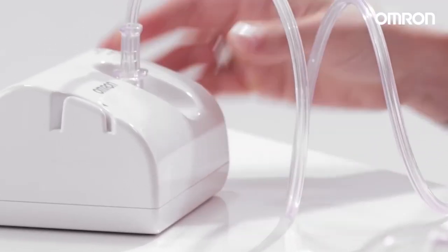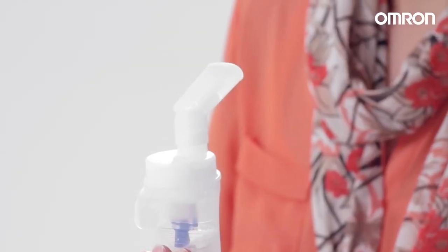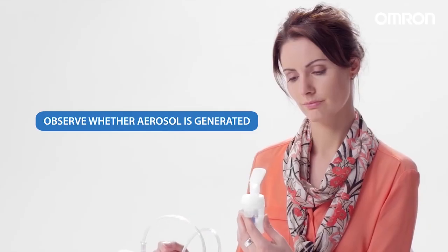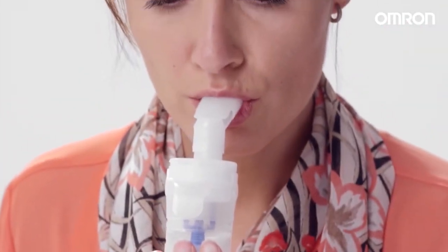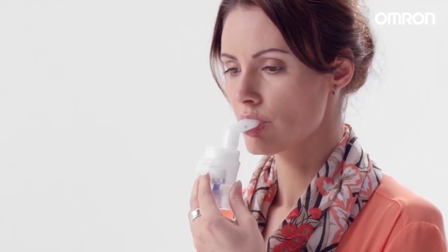Press the power switch and the nebulization process starts. Observe whether aerosol is generated. Insert the mouthpiece into your mouth and inhale the medication, breathing normally.